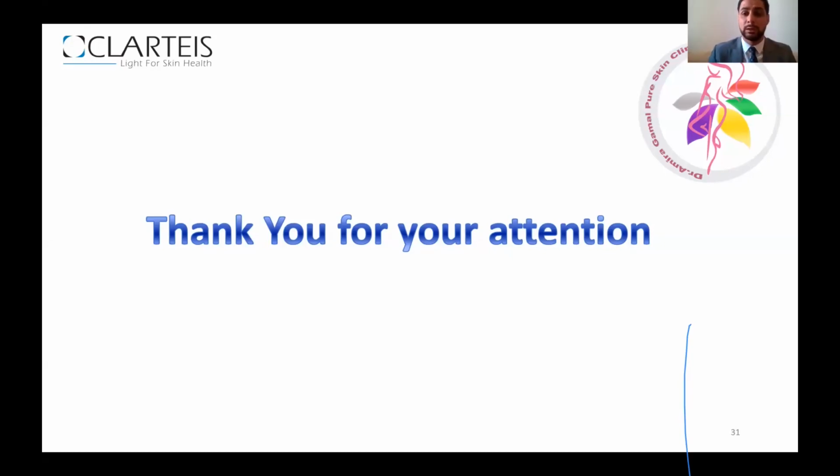Okay. I want to answer a question from Dr. Nadim about if we have small spots, how can we use a large handpiece? Actually, Exciplex has different shapes. We have reduction tips, so we adapt it to the affected area. We have a very small shape. I use it when we have hypopigmented, small areas. You can target the area only.